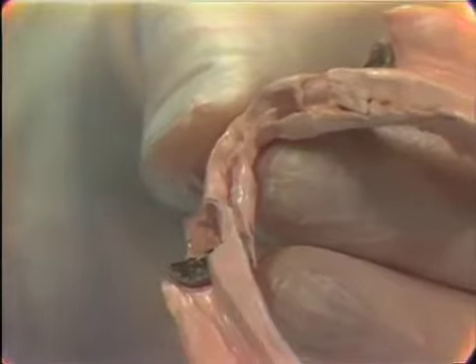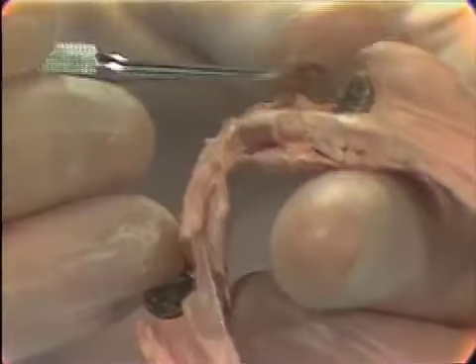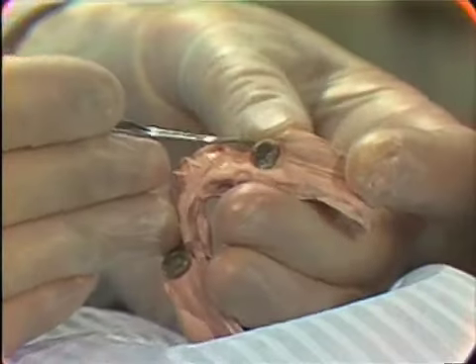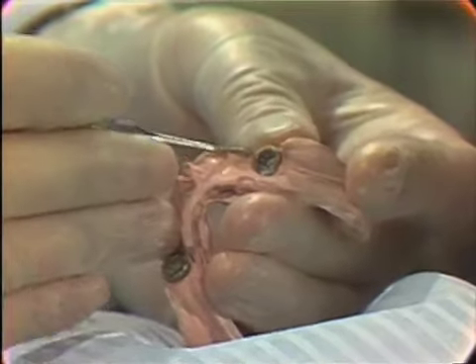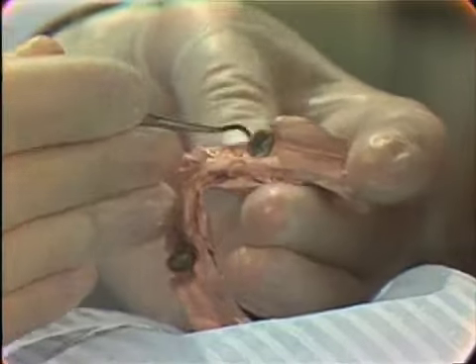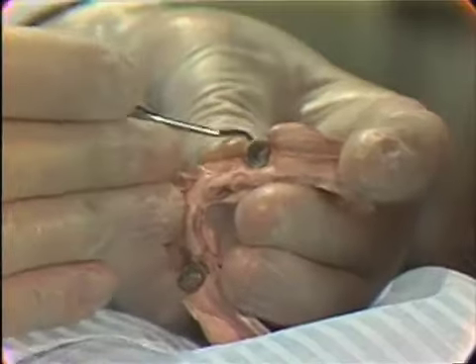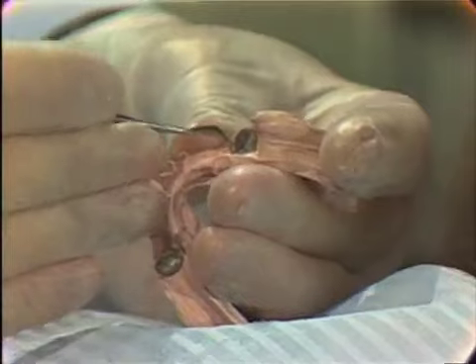Now we would like to have the impression around the necks of the teeth. We can take these crowns out of there. We would like to save the area around the necks of the teeth so we can tell where to finish our casting. If we can get the crown out of there.